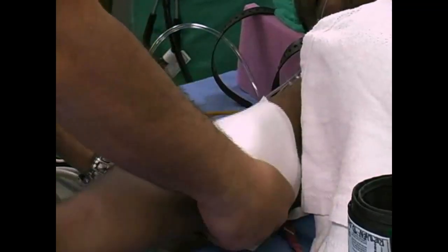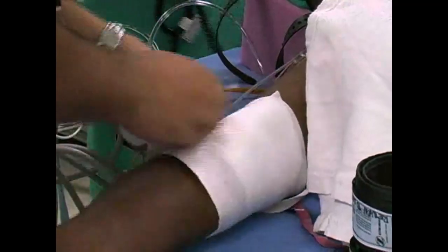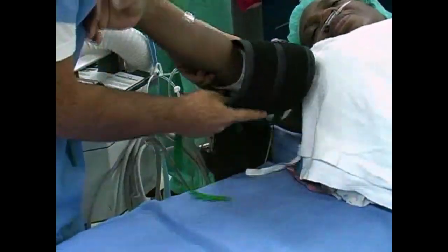Apply the Coban around the limb where the tourniquet will be located. This helps to avoid bruising at the site of the tourniquet. Correctly place the cuff on the patient's arm over the soft cotton wrap such that you align the proximal and distal bladders to the patient's body.